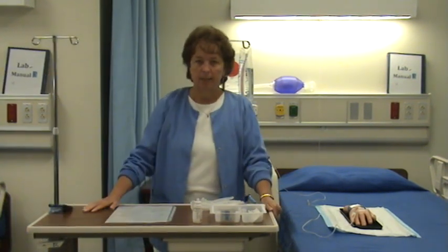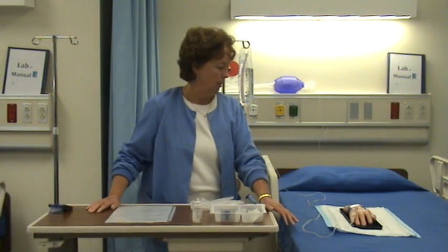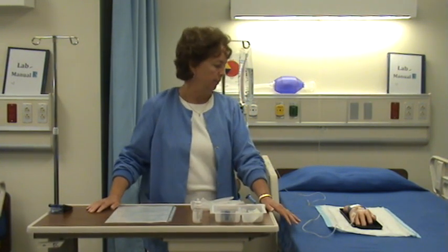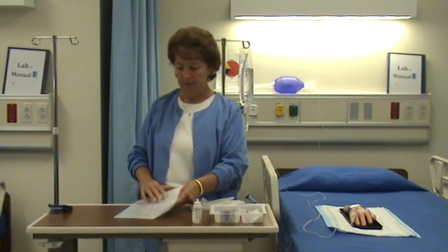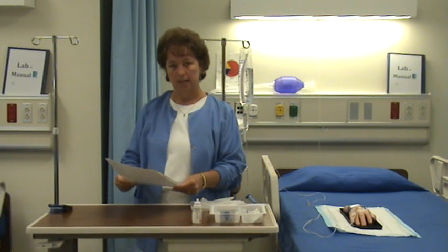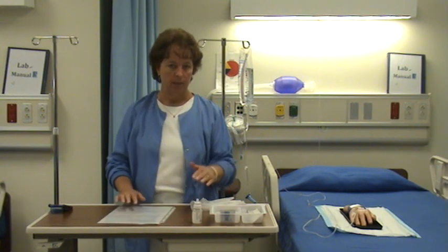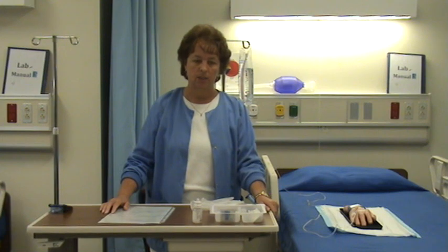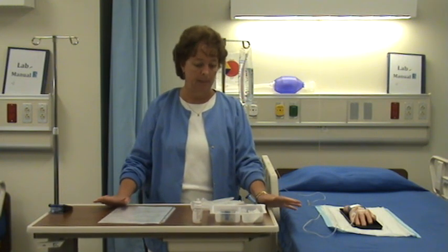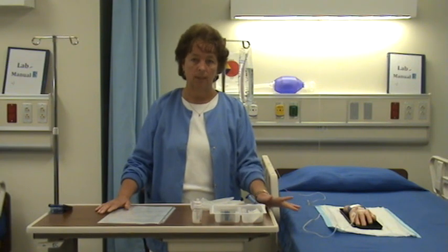I'm now going to demonstrate giving an IV push medication through a running IV, and the IV is compatible with the medication. The order that I have is Lasix 20 milligrams IV push stat. So I look up Lasix and find out the side effects, the actions, and all the things you normally find out about medication. And then also, because it's IV push, I need to know two things.